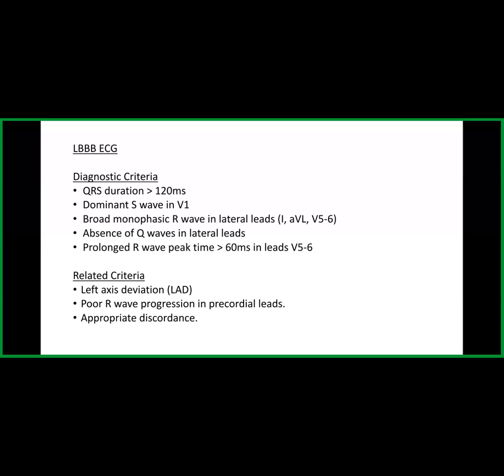When I talk about the R wave here, as cardiac technologists, we talk about the entire QRS complex, but the positive deflection of this QRS complex is what we're talking about, the R wave. So up there at the tip, instead of it being a sharp pinpointed type of wave as we saw before, it's going to be monophasic or M-shaped in left bundle branch block, as we will see just in a moment.